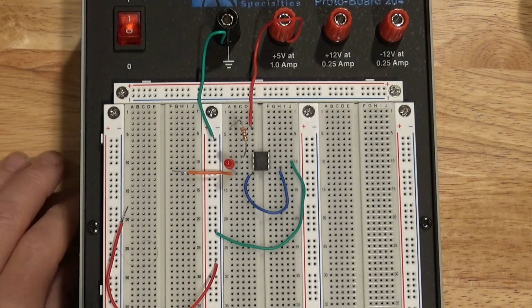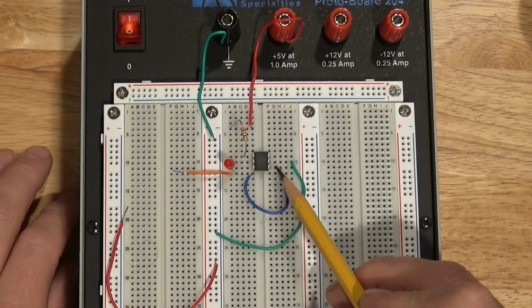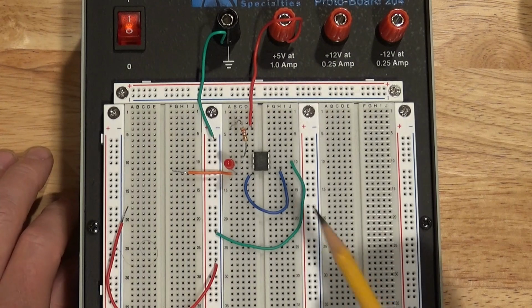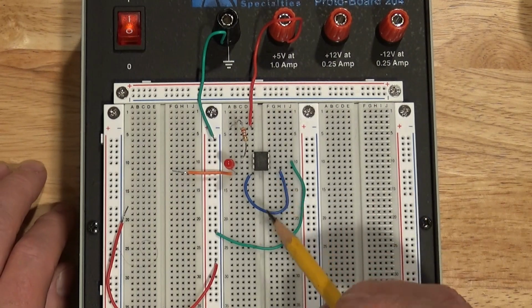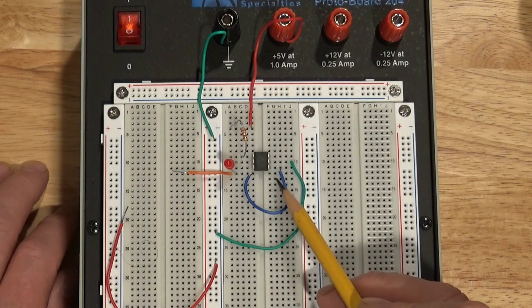So this is the prototype circuit that I used to develop the idea. It's based around this chip here. It's a 6-pin DIP, and I like to use these a lot. They're optically coupled solid state relays, and there's a lot of different devices that will fit in and work for this one. But this happens to be the LCA 717.